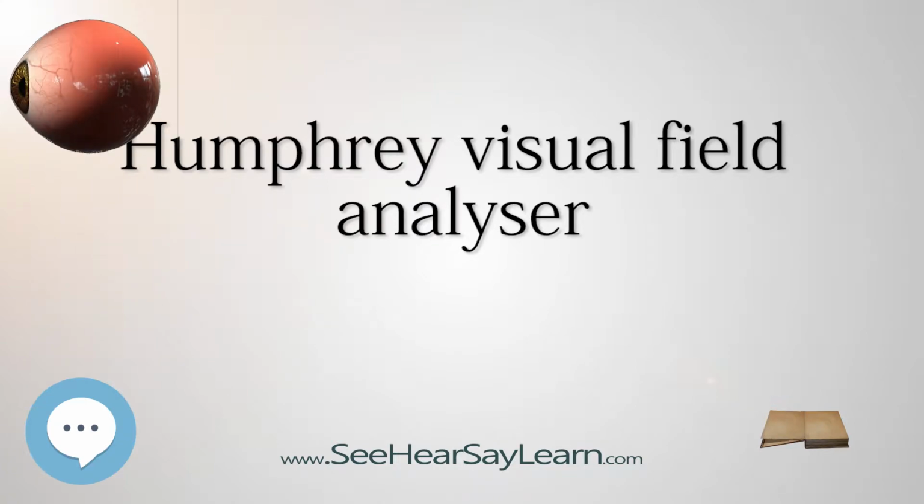30-2 measures 30 degrees temporally and nasally and tests 76 points. Used for general screening, early glaucoma and neurological conditions. The above tests can be performed in either SITA Standard or SITA Fast. SITA Fast is a quicker method of testing. It produces similar results compared to SITA Standard, however repeatability is questionable and it is slightly less sensitive.